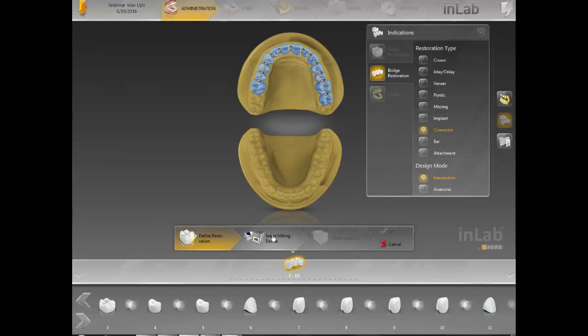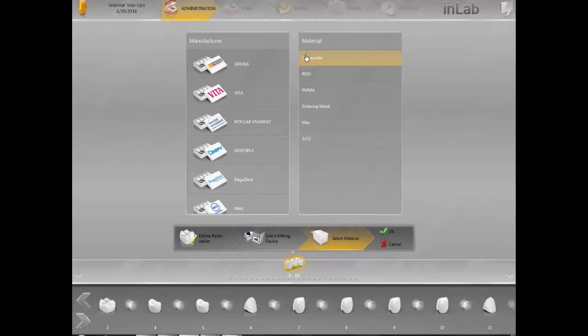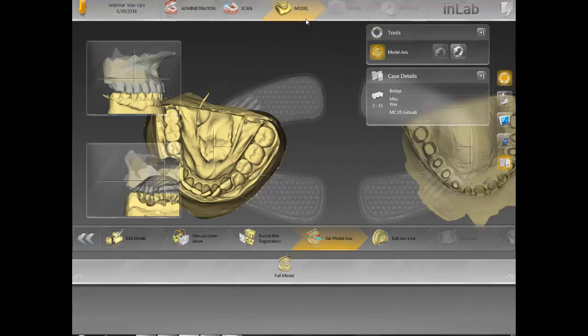At the end of this design phase, I'll show you pictures of different cases we've done, whether they're single or full bridge. It's kind of your preference. If it's single, it's like a jigsaw puzzle. When it's one connected bridge, it makes life a little bit easier when you're going to process the case after it's milled. So we'll move on to the next step — click on model.